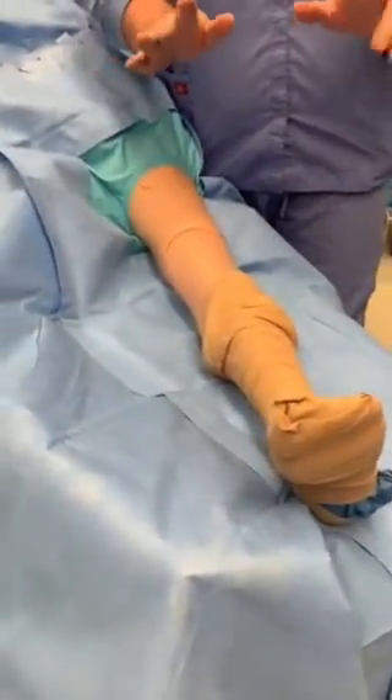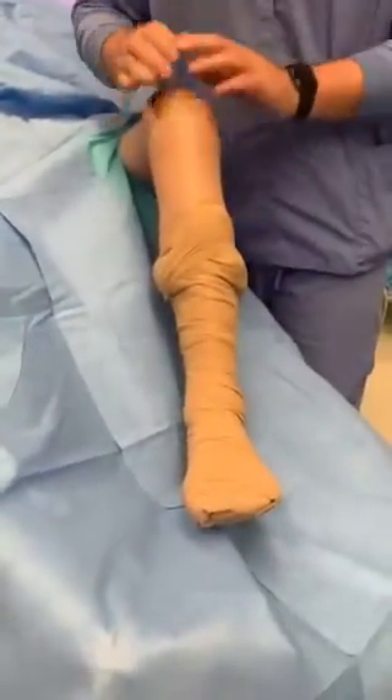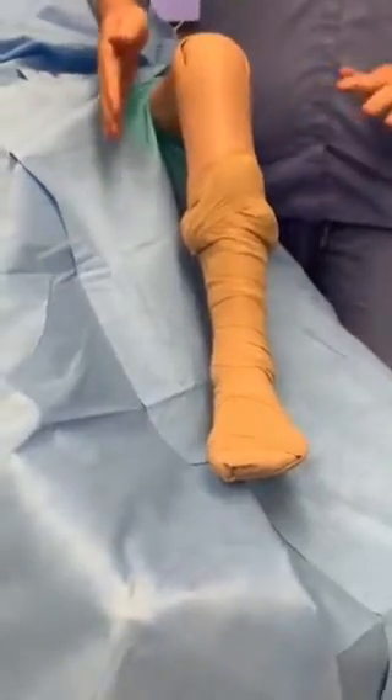Okay, so incision down the knee — this is in the video you saw already — incision down the middle. Prop the knee up, you'll have your bump there, and that'll expose the knee, skinning on the side.